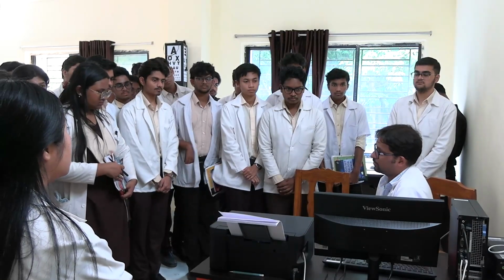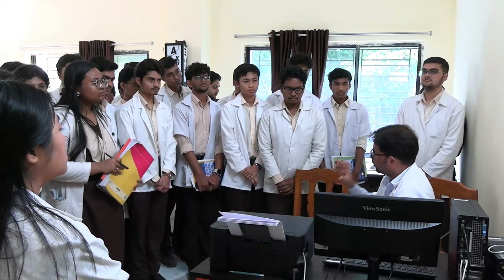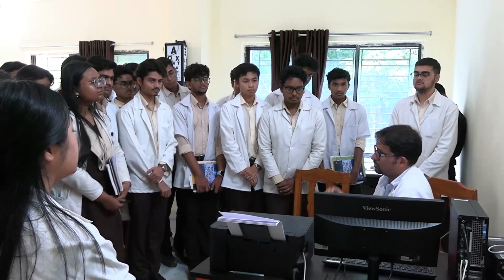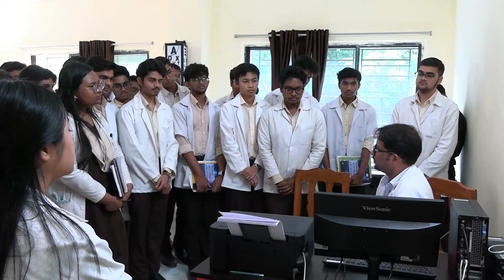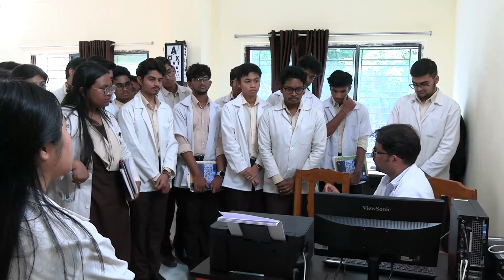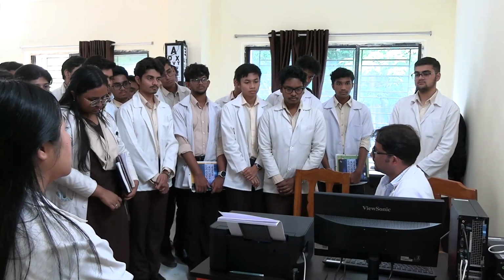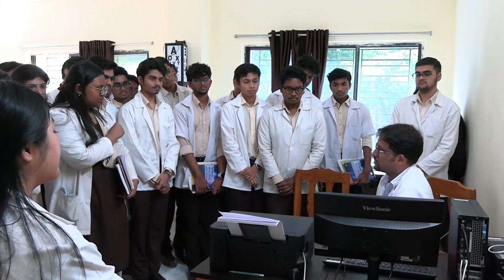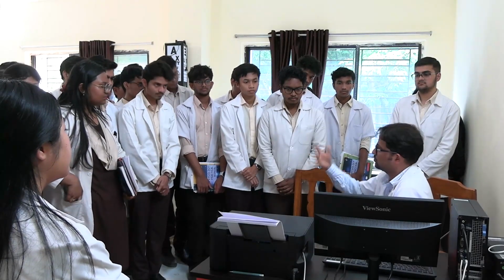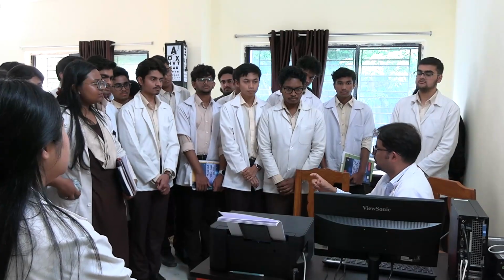So digital spirometry is measurement of volumes as well as flow rates within defined breathing maneuvers. So we cannot do anything at our wish. Breathing maneuvers are defined. As per that breathing maneuver, what was the volume that has been exhaled and what was the flow rate? That means the velocity at which the volume was exhaled out, or for that matter inhaled. So there is this component of time.